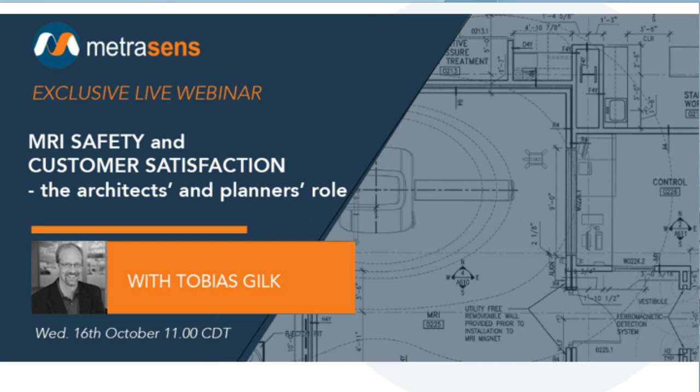So if you get the more advanced systems, you don't necessarily need that physical separation to benefit that function, but it still is preferable even with those more advanced systems because, again, it separates the door opening from the individual approach and makes those two distinct elements, and so people better understand the alarm is for the individual and not for the door opening.